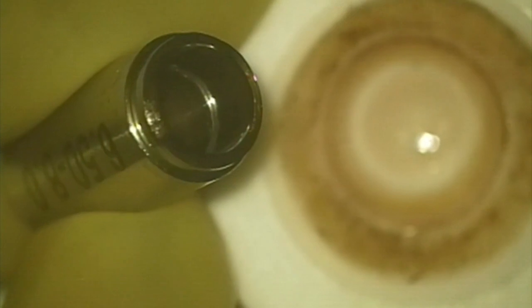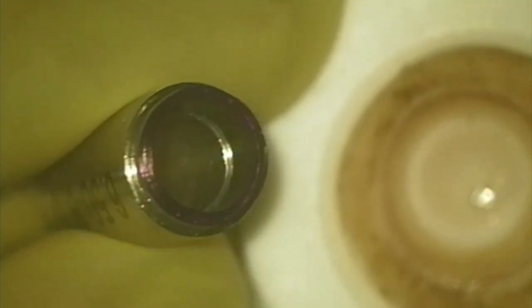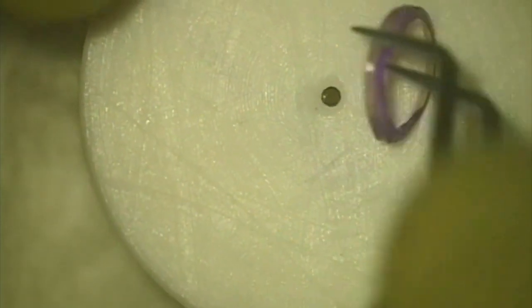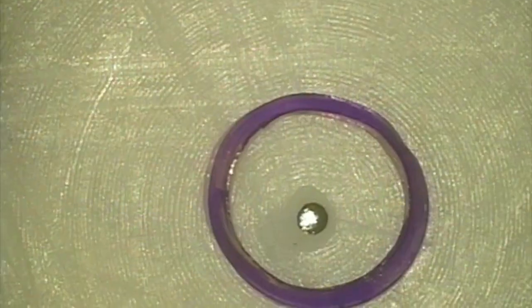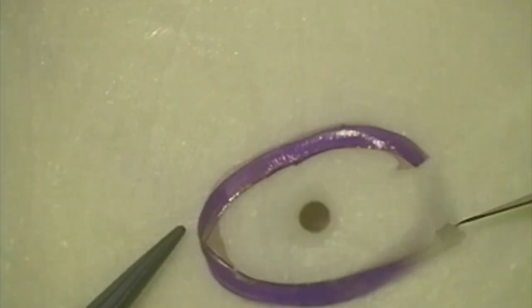We now have the circular segment of donor stromal tissue present between the two blades of the trephine. I mark the Bowman's side using a marker pen, then remove it from the trephine and place it on a Teflon block. You can see that the anterior surface — the Bowman's side — is marked, whereas the endothelial side is not.